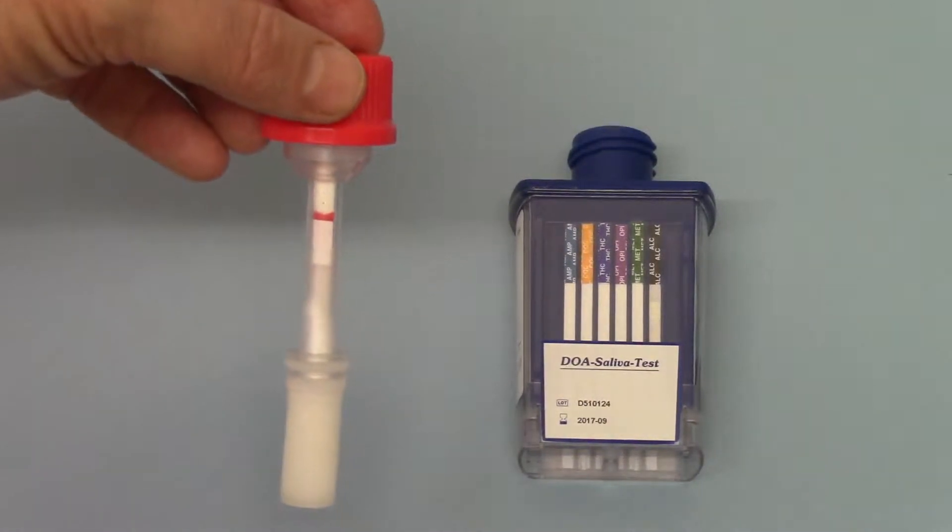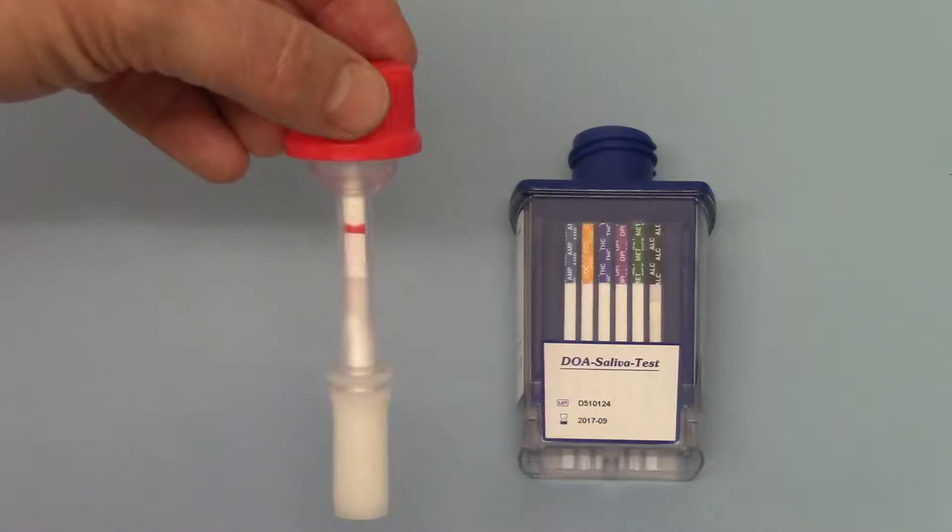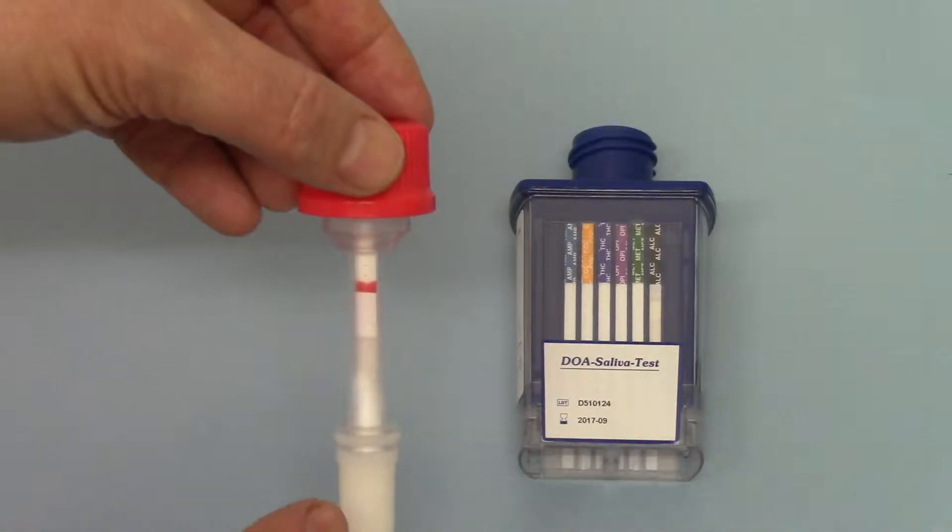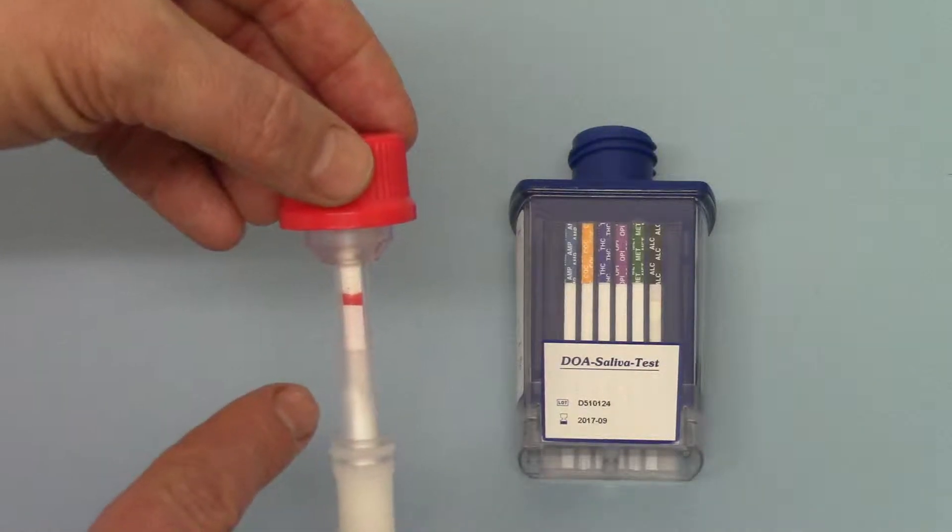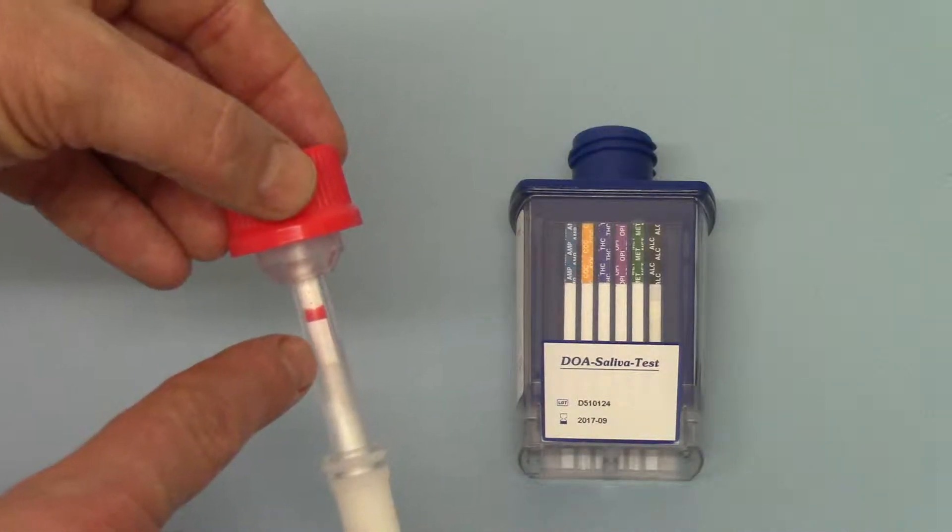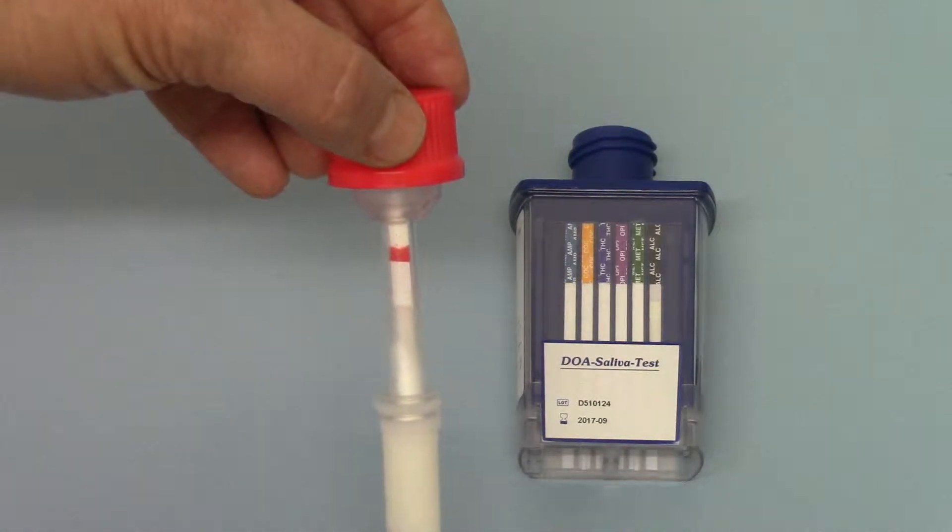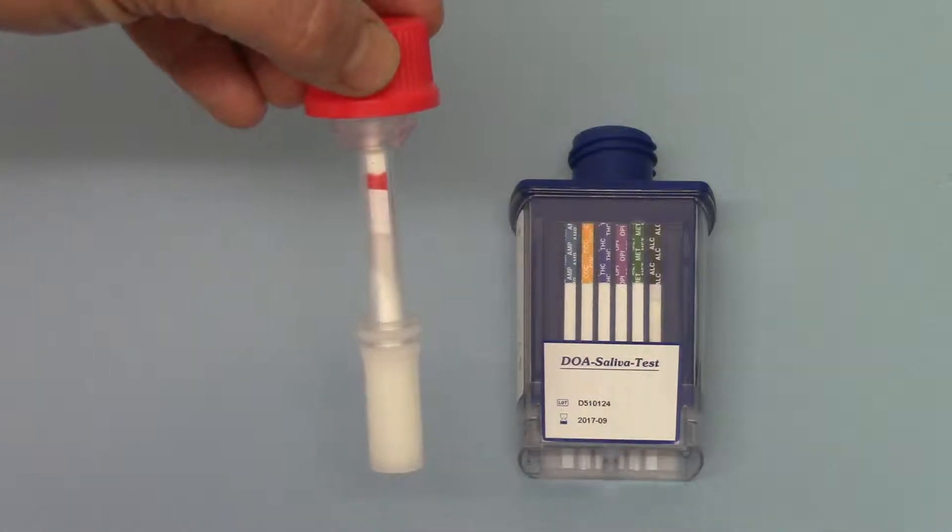Okay, welcome back to part two. Now we're showing you the saliva indicator. When sufficient saliva has been absorbed by this membrane above the white section, the top section will go a bright red color. You can see that still tracking up, indicating that sufficient saliva has been absorbed.